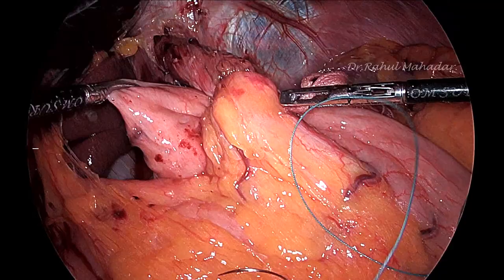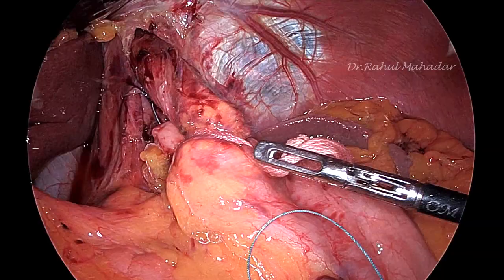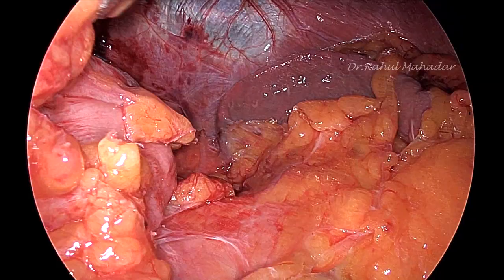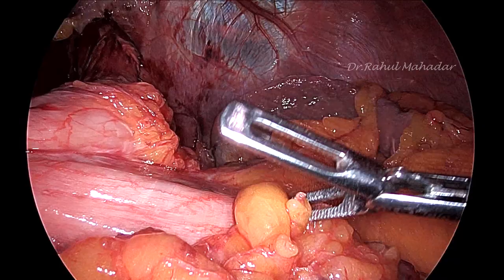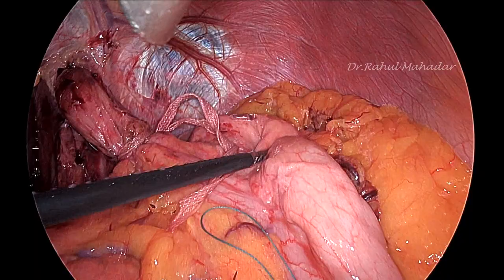And you find that it is going back. So still there is some traction on the stomach. So we need to find out what is giving a traction to this particular area. So there are few adhesions between pancreas and posterior wall of the stomach. So we need to cut that, and we have to make this particular posterior part of the stomach free.